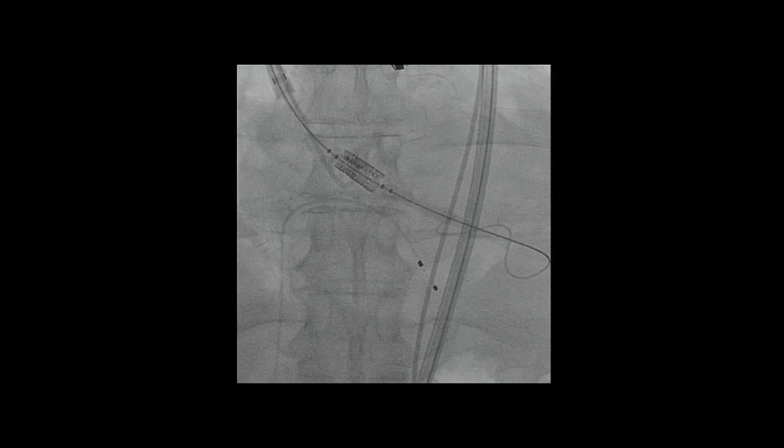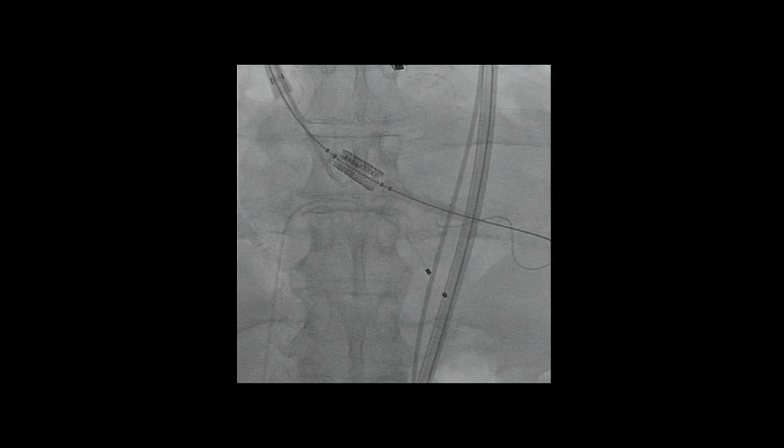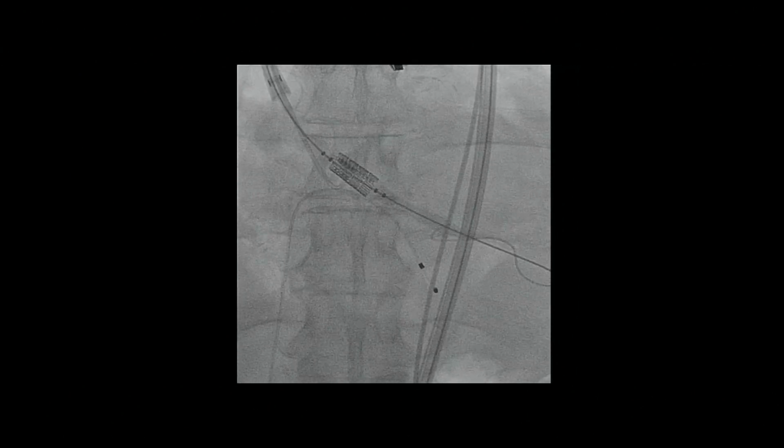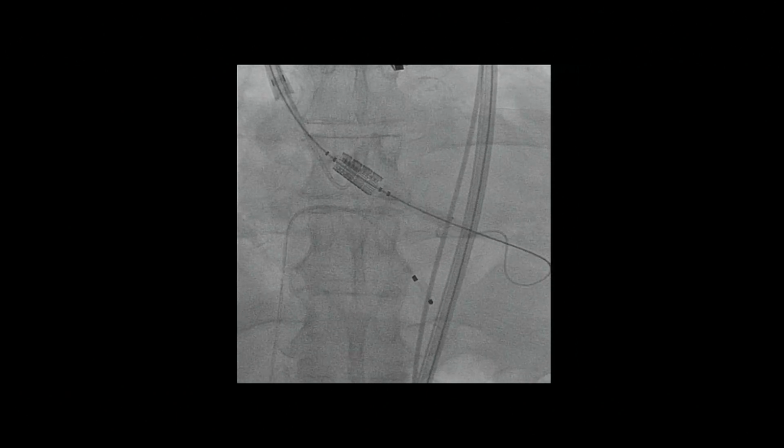A lot of times these patients will have transesophageal echo that assists with placement, looking for post-implant complications. Then our anesthesia colleagues will typically put in monitoring lines from the neck. They may or may not have a temporary pacemaker wire from the neck after the procedure. But I just wanted to at least show you what it looked like so that what I'm talking about has a little bit more of a concrete anchor.